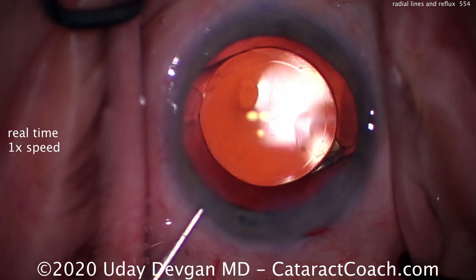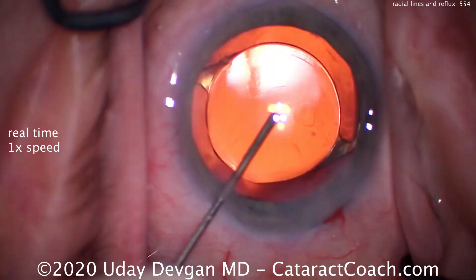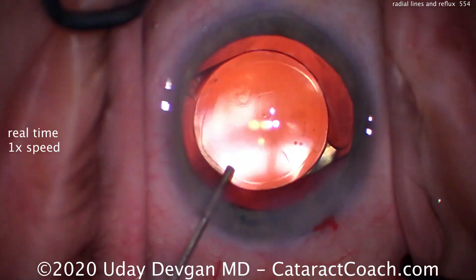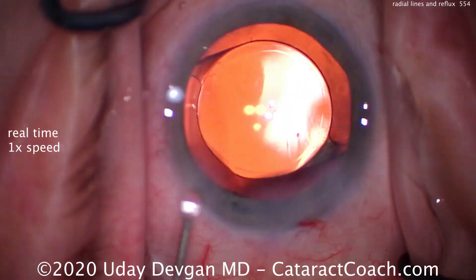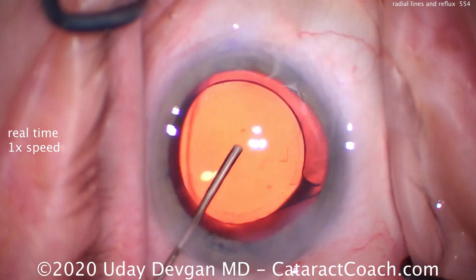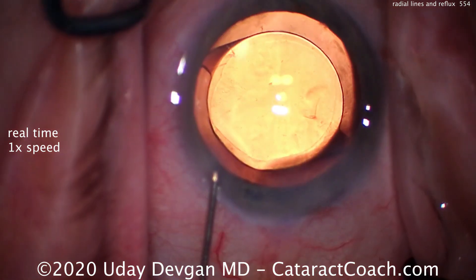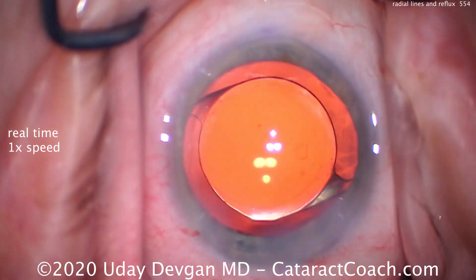For this patient, at the end of the case everything looks great. There's the IOL very nicely centered in the capsular bag. There's the capsulorrhexis with very good overlap of the optic for 360 degrees. Incisions look great — sealing those up, just repositioning the lens to make it perfect. A beautiful outcome, and of course the posterior capsule was intact.